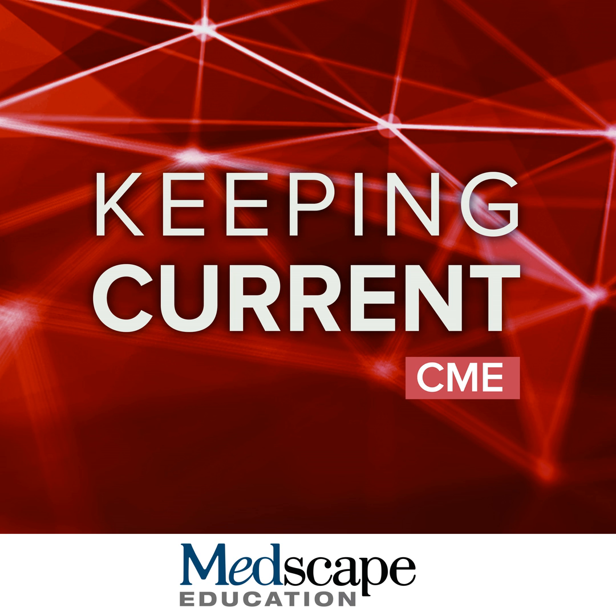Case number two, again, you can see that there is thinning out towards the apical part of the septum. And if we go to the image on the bottom, you can see that that thinned akinetic segment is also transmurally enhanced. So clearly there's an infarct here, and the infarct is involving the basal and mid portion of the septum as well.